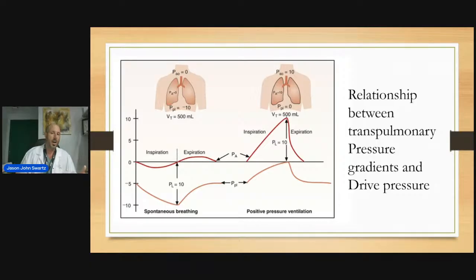This is why I love electrical impedance tomography, where I can measure end expiratory lung volume, and I can apply greater PEEP to the patient, or mean pressures, or with APRV, using pressure, as well as extending time for recruitment, and looking and seeing the trend. Are we recruiting more functional residual capacity? Because if we are, that means more alveoli are coming to work and taking part of the stress.